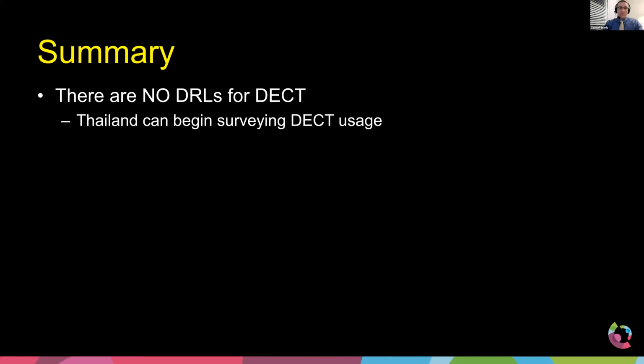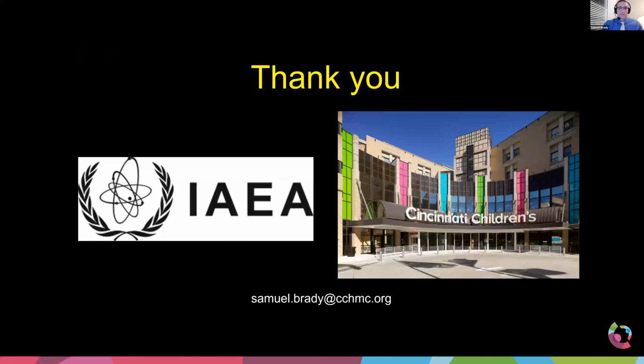And so this is a great opportunity that as Thailand now starts to install their dose tracking software throughout the country, probably at the larger academic centers, you're going to do more dual energy than your community centers. But as you start to collect this data on how you're using dual energy, and how much radiation you're using in those scanners and the types of scanners you're using, you'll be able to establish your DRLs. But you'll also be able to look at the greater, broader picture in all of Thailand as to how best to approach image quality and more specifically dose optimization for dual energy CT.